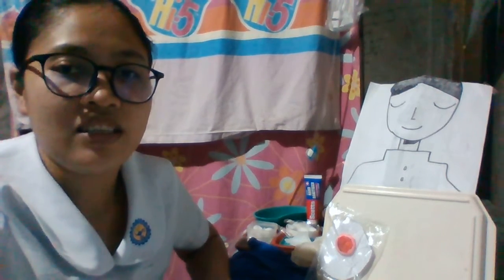Then next we're going to review the stoma considerations for the color, size, and shape, and bleeding tendencies and healing status per client's record prior to seeing the client.